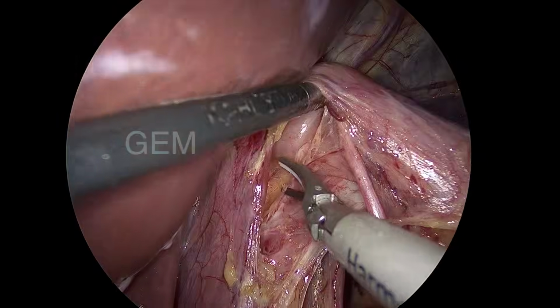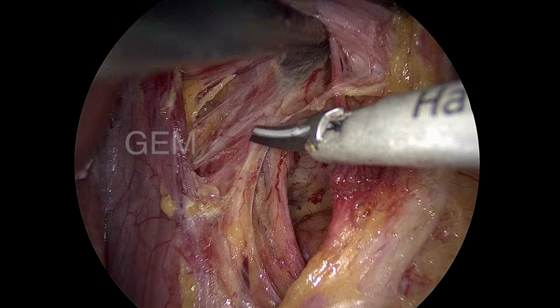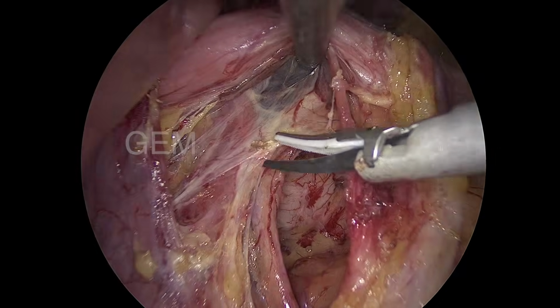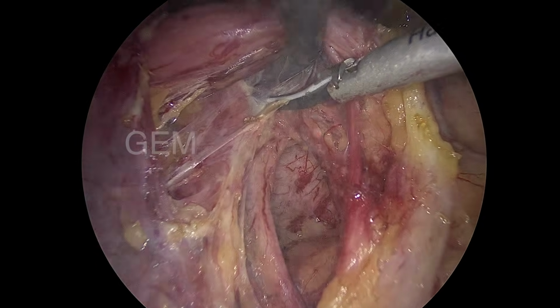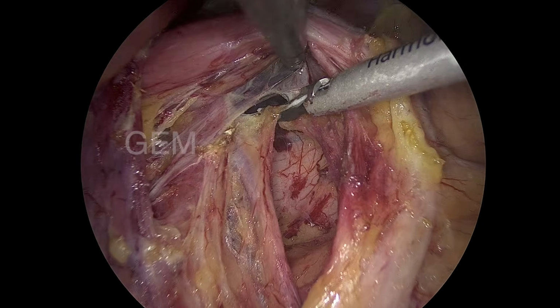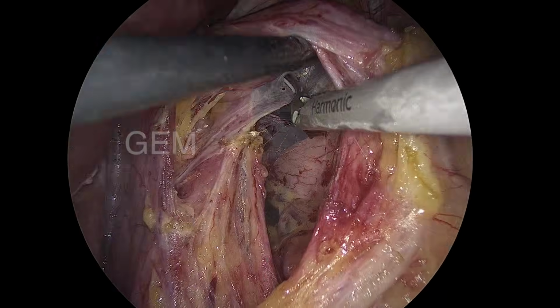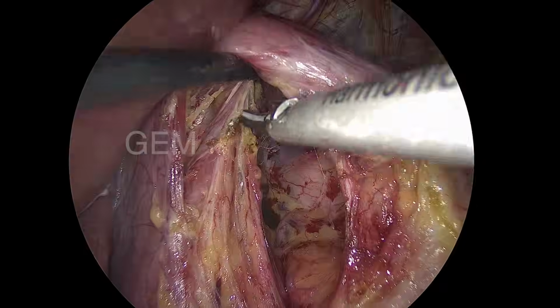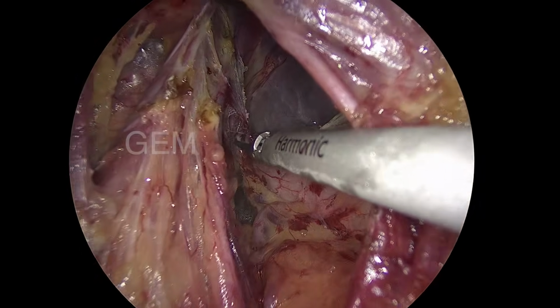I am using Harmonic HD. You can see the very sharp tip. So, I am dividing it, now you can see the phrenoesophageal membrane very well. I am dividing the phrenoesophageal membrane from the crus. Below is the inferior phrenic vessel. So, now the inferior phrenic vessel attachment is being divided. So, that is the phrenoesophageal membrane. So, now the esophagus is mobilized completely all around.